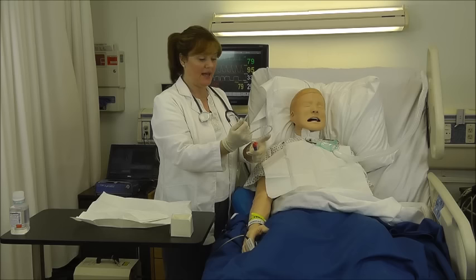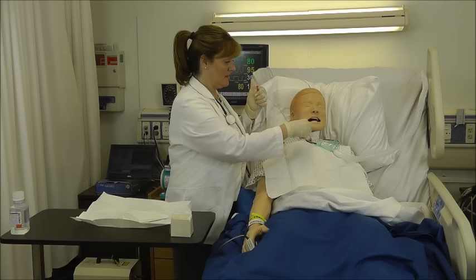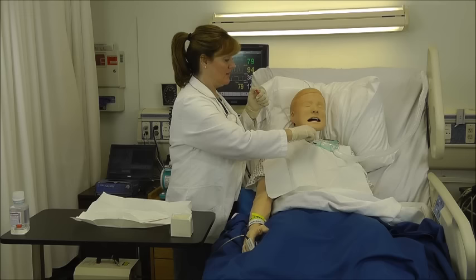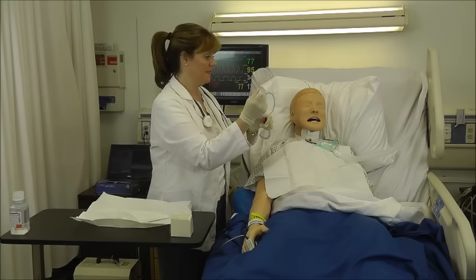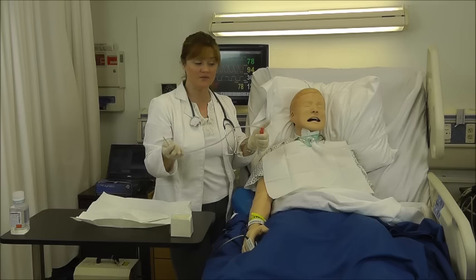Again, my thumb is off the catheter, and I will only advance to the 20 centimeter mark so I don't hit the carina. Keeping it taut so it doesn't hit anything. Down to 20. As I pull out, I apply suction intermittently, and I'm twisting the tube out to clean the trachea completely. Again, I've only stayed down 10 to 15 seconds. He needs at least 30 seconds to recover. I'll note those same qualities of these secretions, and then I'll clear my line.